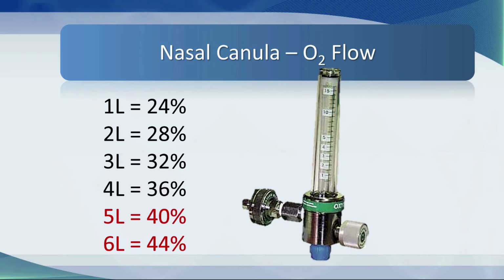Remember that, of course, once you get above 4 or 5 litres, you're getting pretty high flow going in there, and it can be quite irritating for the patient.